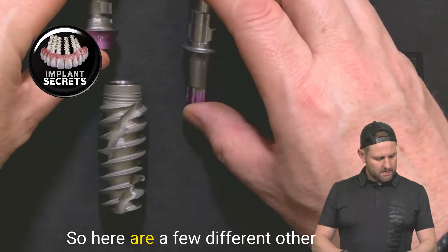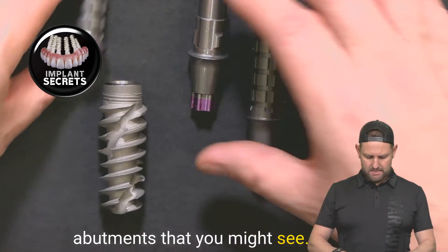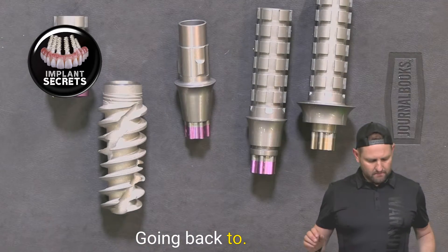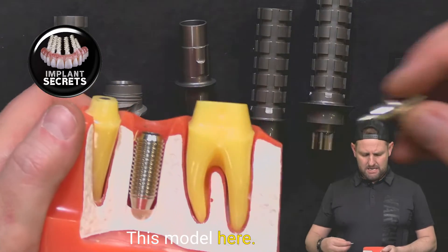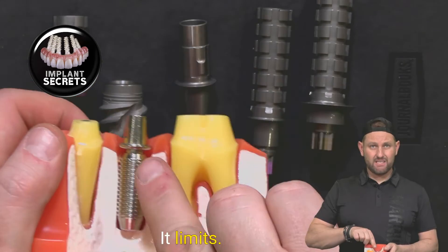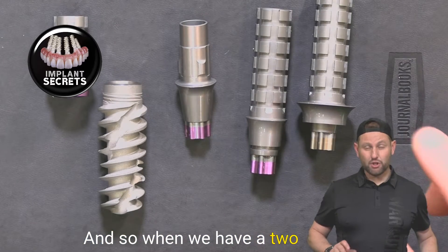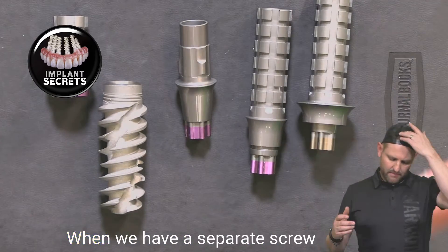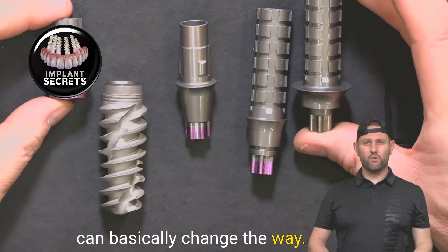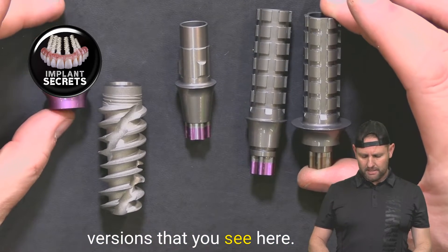Here are a few different other abutments that you might see — just different versions. Going back to this model, when the screw is attached to the abutment and it goes in, it limits what you can do and how you can change things. When we have a two-piece implant — a separate screw — we can basically change the way that abutment sits on top. These are just different versions of that.